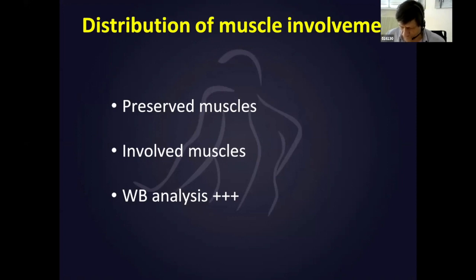While abnormalities may be very recognizable in lower limbs for some of the myopathies, others need scanning of distant regions of the body to find more conclusive features, and therefore the whole-body scanning technique will often be more contributive. This is the case for most congenital myopathies, in particular those presenting with mutations in selenoprotein, dynamin 2, ACTA1, and nebulin myopathy.